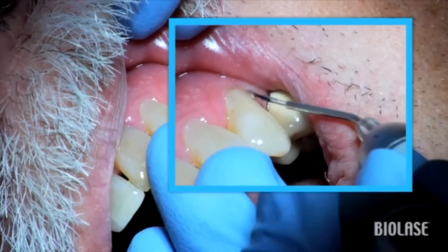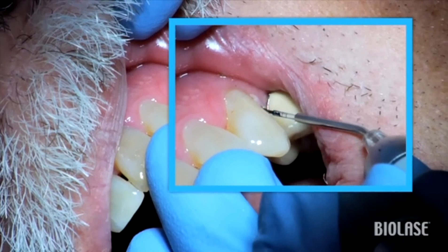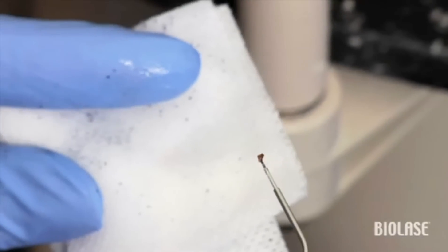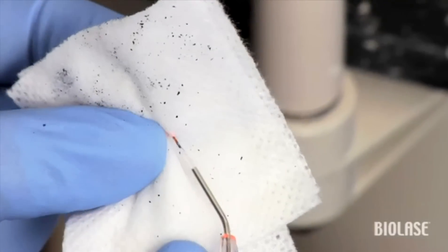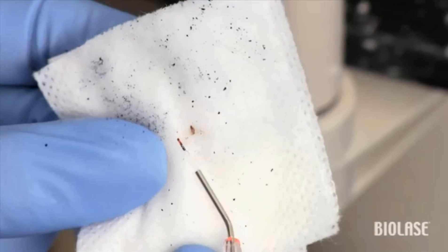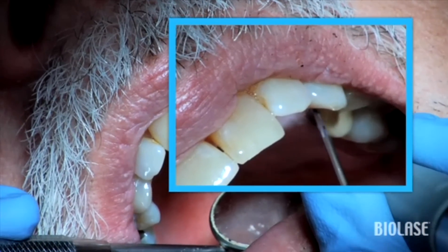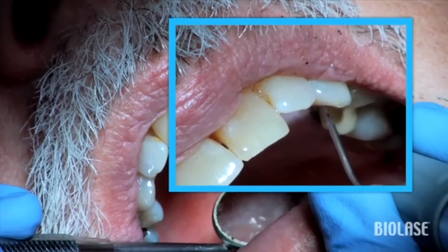You will be looking for tissue at the end of the tip as well as reduction in bleeding or inflammation when present. Gently wipe the fiber as needed throughout the procedure, and reinitiate the tip if necessary. For lingual surfaces, the technique is the same as both the buccal or facial aspects.